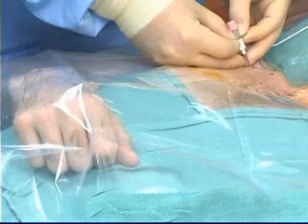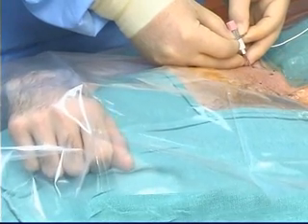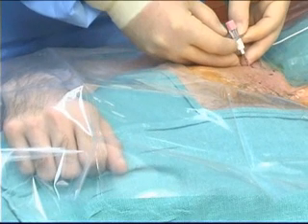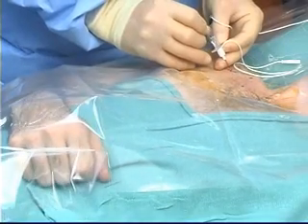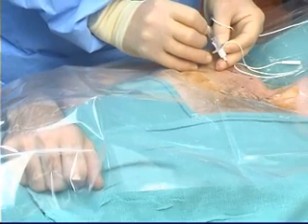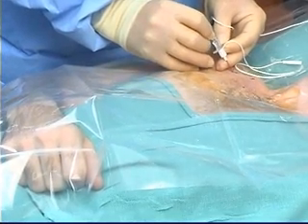The bevel of the needle is always pointed in the direction that the catheter is intended to go. The needle is now on the posterior cord of the brachial plexus, and the pinky moves posterior. The nerve stimulator is set to 0.5 to 1 milliamps, an output comfortable for the patient, and attached to the proximal end of the stimulating catheter.